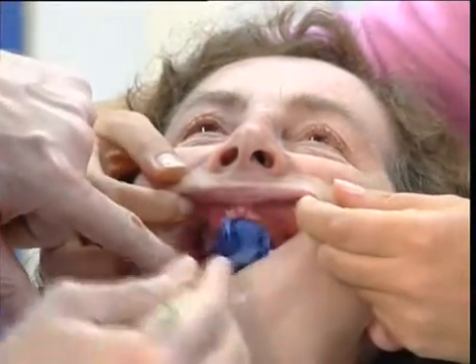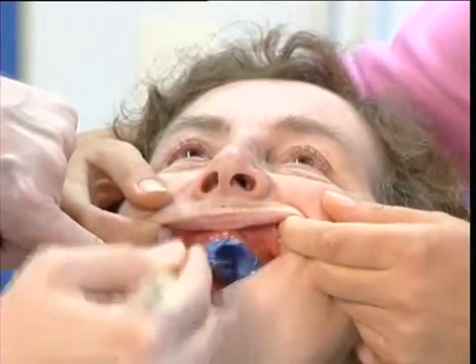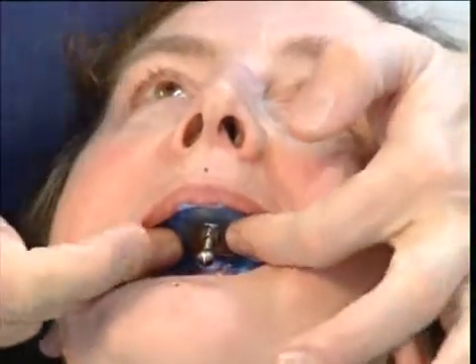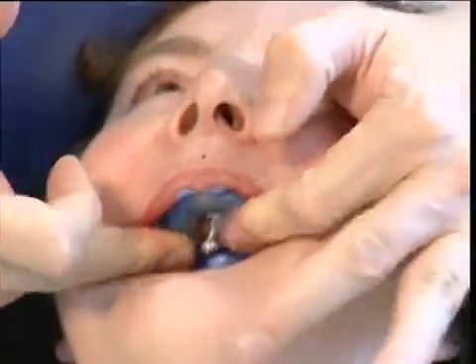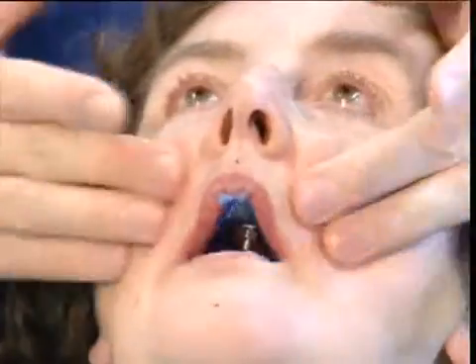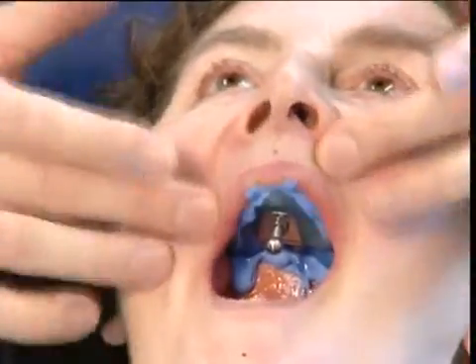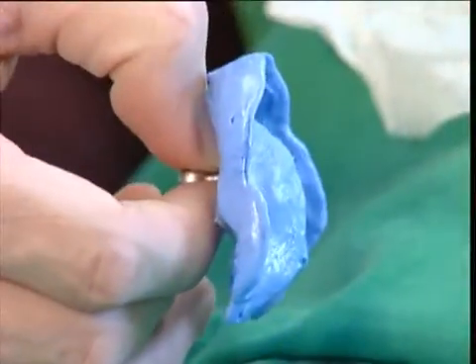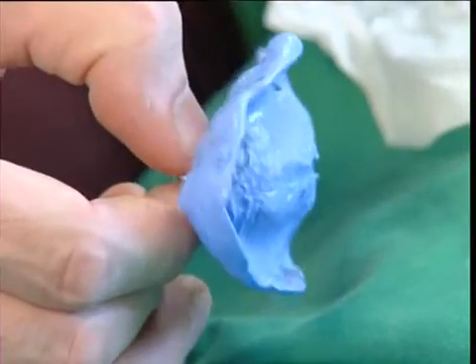The extra portion on the mixing pad is applied directly to the palatal mucosa with a brush. The upper tray is placed in the mouth, gripping it with the tracing ball. The cheek sections are pressed intensively to form them. A sucking action should be carried out to form the vestibular musculature. Check the impression, reduce bare areas, and cut off excess material.